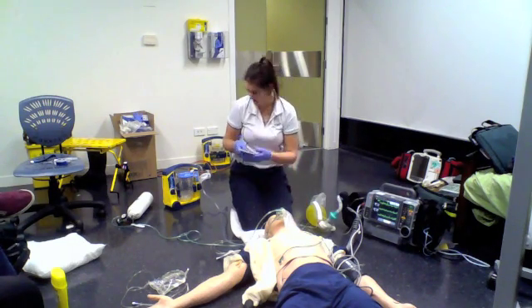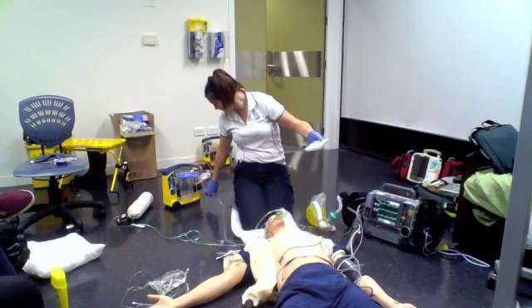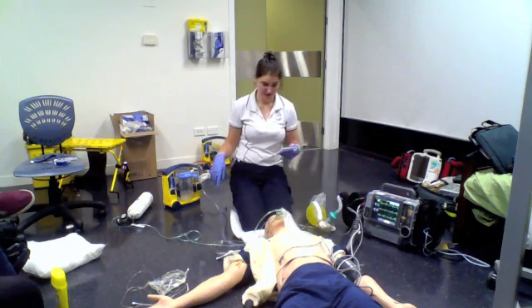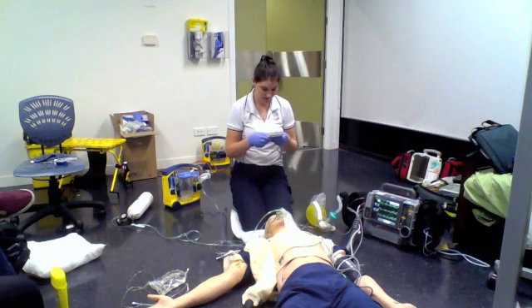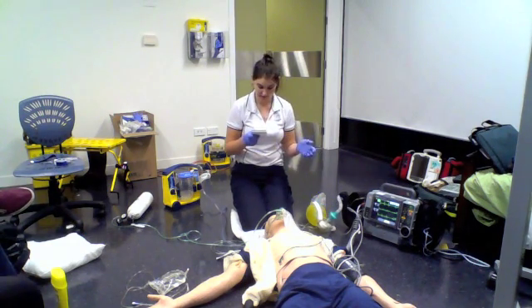The suction unit, we've tested that it's working, and we've made it go right up to 500 millimetres of mercury, and we've got the suction catheter on there under the shoulder. We have got the manual BVM mask with PEEP attached. We've obtained a full set of vitals.